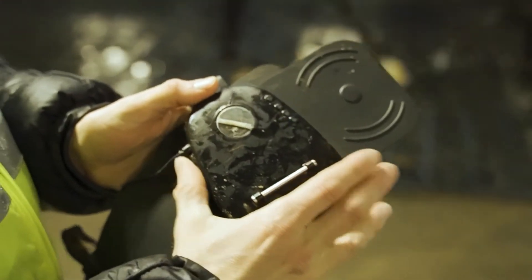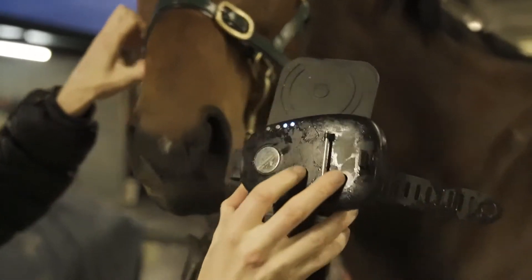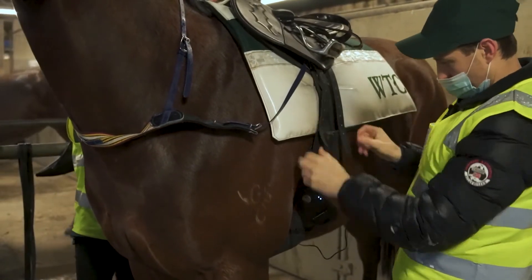To start the session, turn it on like that and then we can come over to the horse and scan its microchip. The two blue lights mean it's now recording. It sits neatly there in the hollow of the girth so it picks up a good reading of the heart rate.